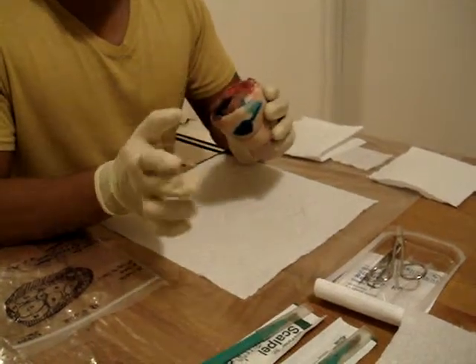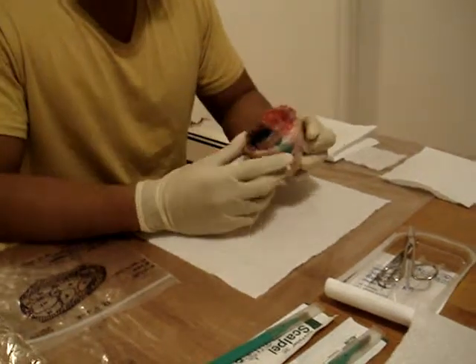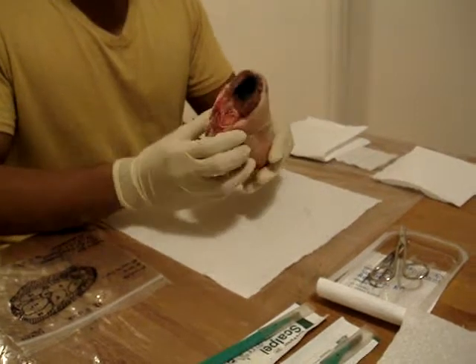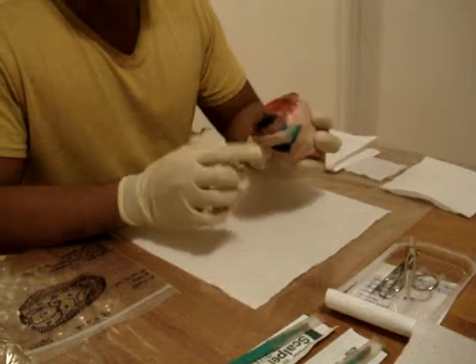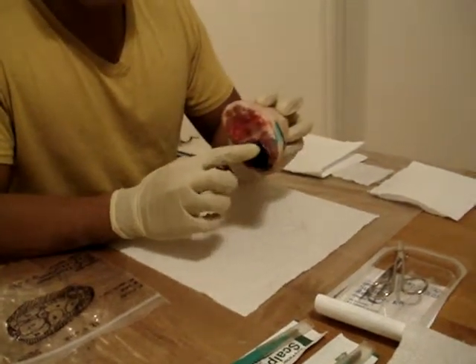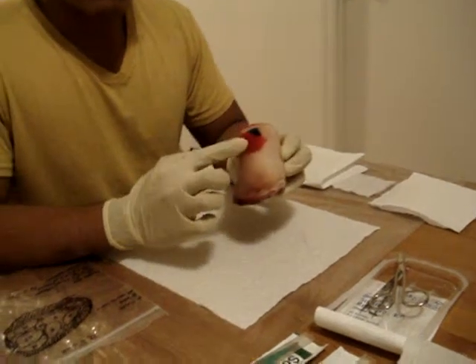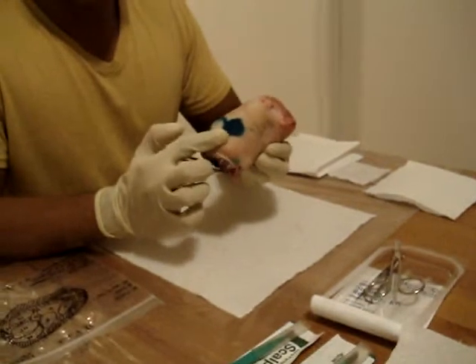Hi, we are going to discuss now our assignment for week 4, which is the sharp debridement lab. But before that, let me orient you to the ham hock that I will be using. I have labeled the ham hock, I have dyed it in 3 parts. So one, the blue spot is in the muscle here, the red dye here on the bony prominence, and also one blue dye here on the skin.